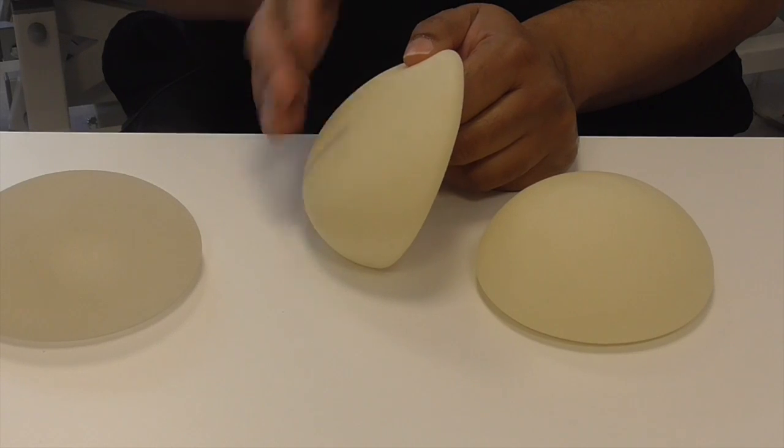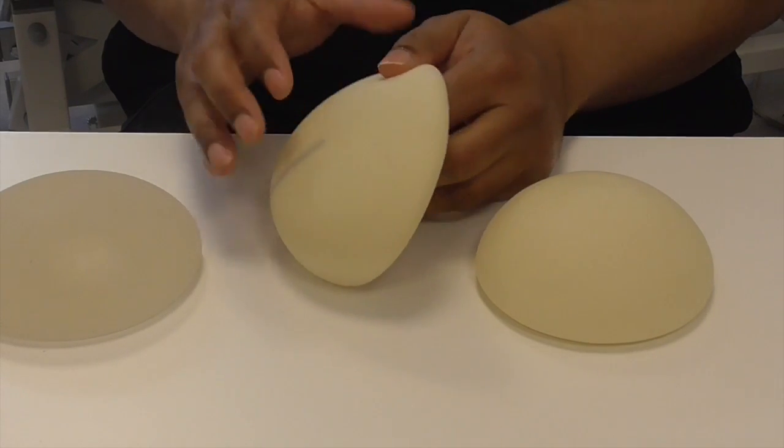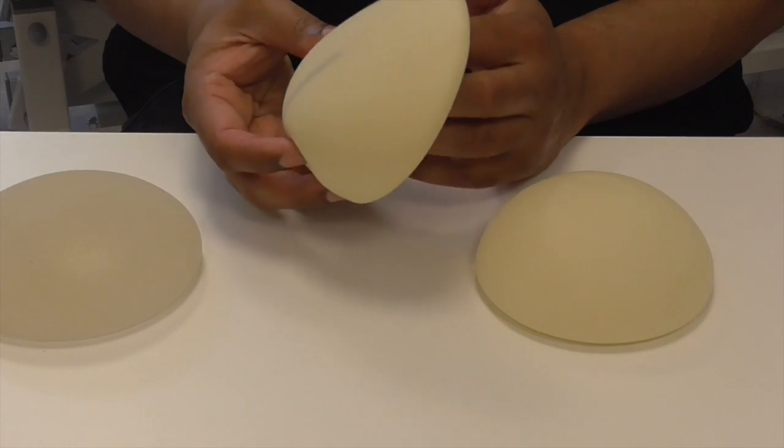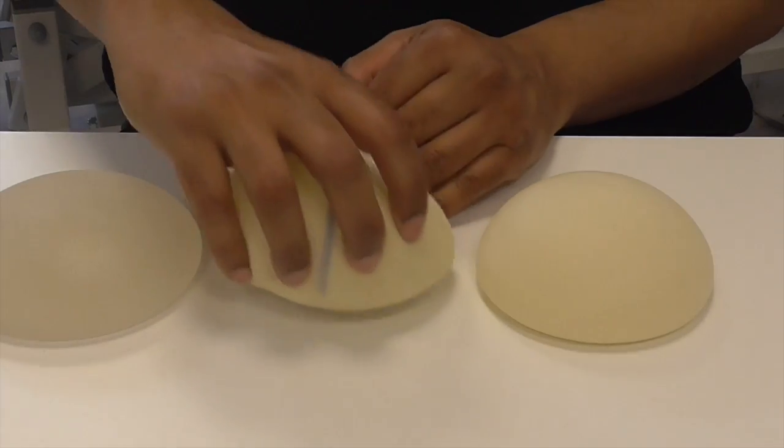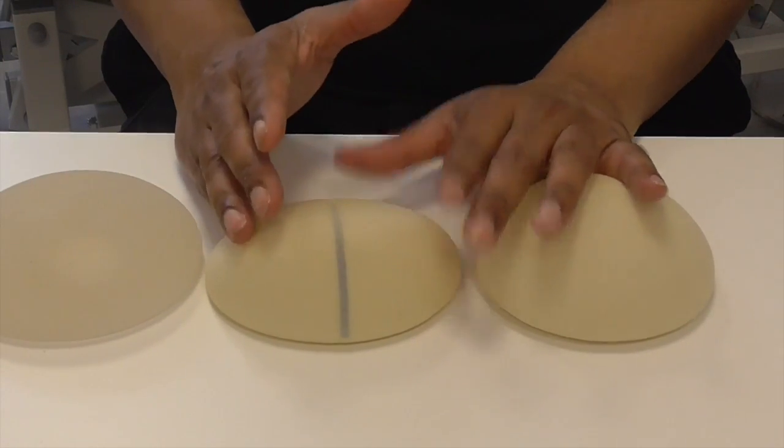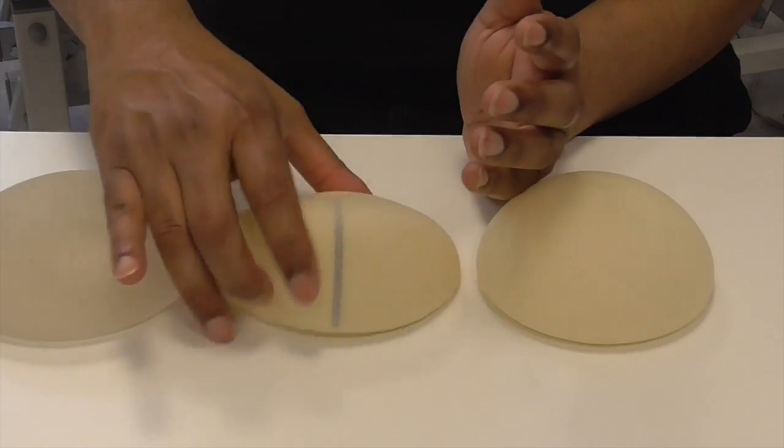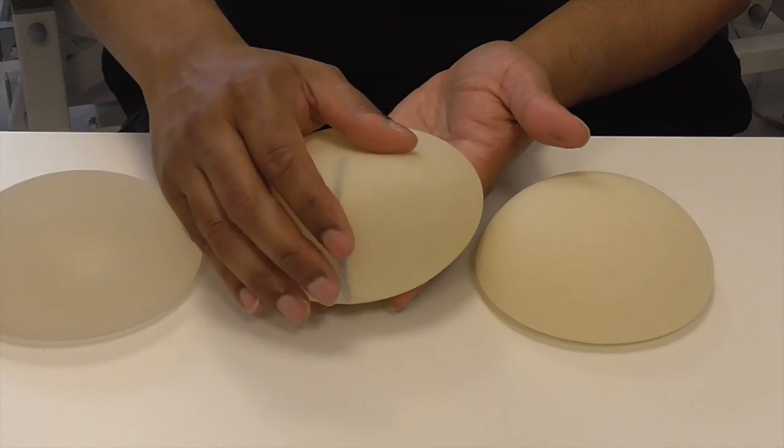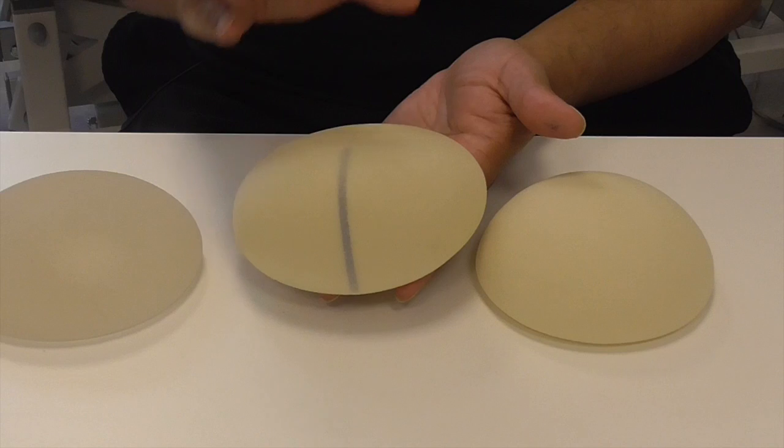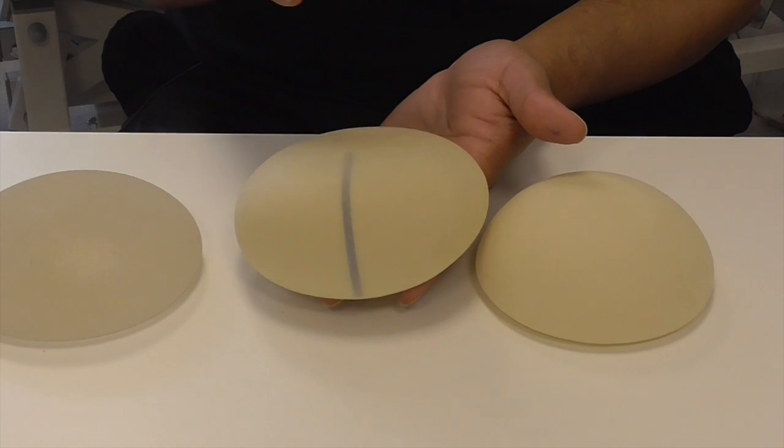If you compare the round to the anatomical, especially in a side view, it's got this what is known as a teardrop shape. This teardrop shape gives one a better breast shape, a better natural shape. If you're putting this implant under the breast tissue, the teardrop shape will probably give you the best outcome, but that's very dependent on the patient and the surgeon and what they're trying to achieve in terms of the aesthetic outcome.